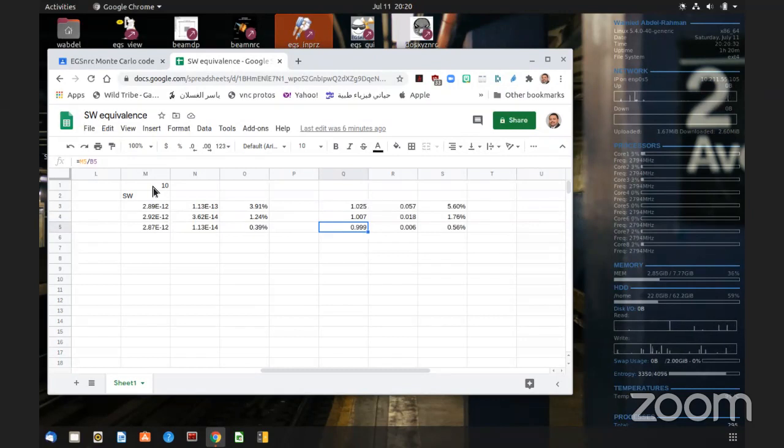For example, I've used a 10 by 10 field. Suppose I went for a smaller beam, 2 by 2. Are they going to be the same? Because my claim is that yes, we're attenuating, but it's compensated by some scattering. The scattering in solid water compensates for this reduction in primary dose or primary photons.